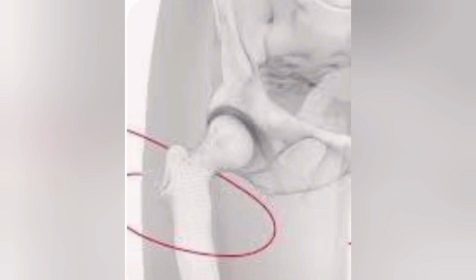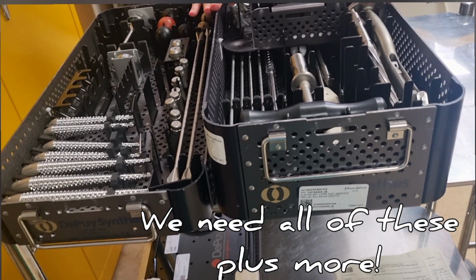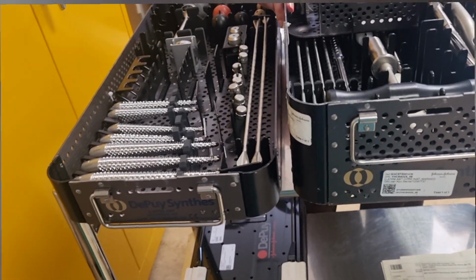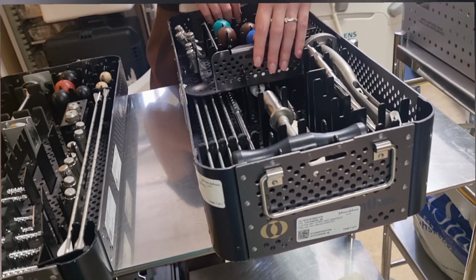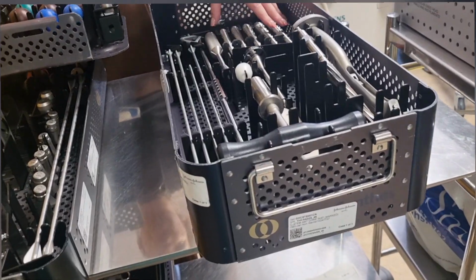For hip fractures, one of the most common procedures I've experienced is the hip hemiarthroplasty, where we have to put an implant in like this. There's a core tray and then there's an outer tray. This is the extended. If you're just doing a standard case, you could probably just get away with opening the core tray, because this has got all the heads, all the instruments you need, and the 1 to 5, the normal broaches. Oh, okay. So the head is already here.